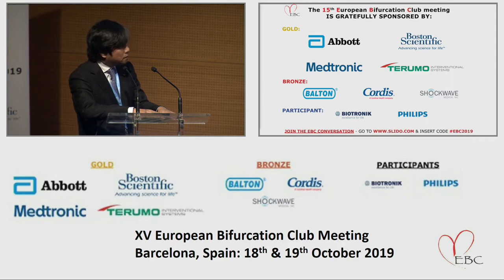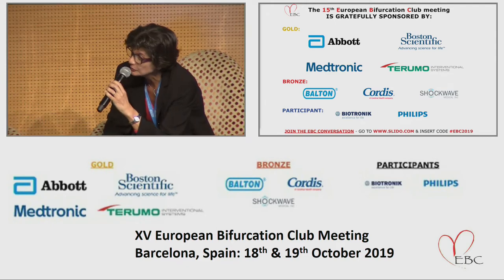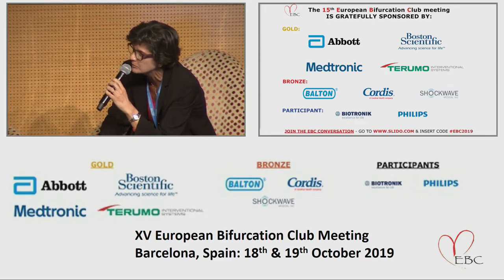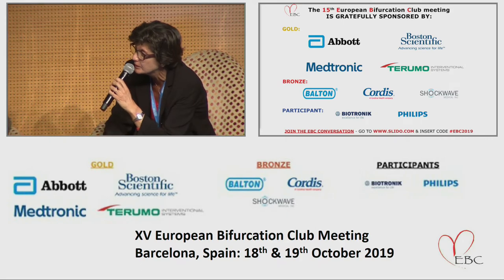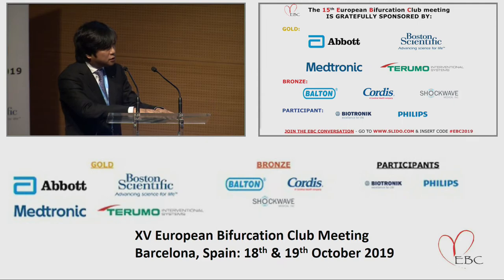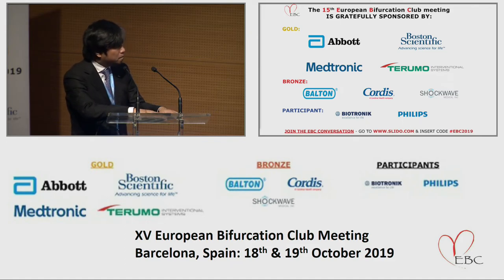A short technical question. You mentioned that only 98% of patients had a POT in your study. Can you explain why 2% of your patients did not have POT? Was it because of technical problems, or because it was suggested by your imaging result, or something else? Yeah, it was just a technical problem. They could not really cross the balloon into the stent, and they could not achieve the POT according to the protocol. So there was only one case per arm where the operator could not perform the POT.